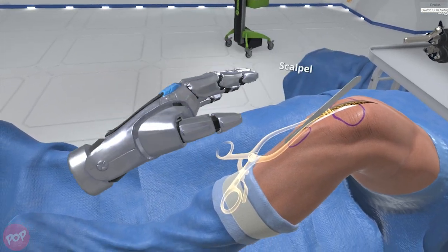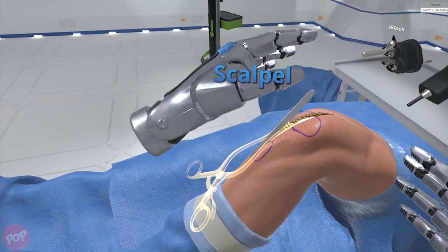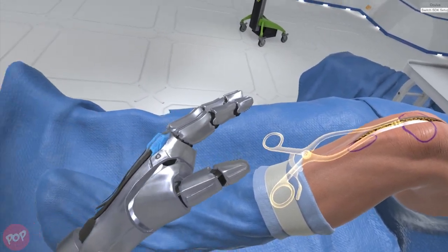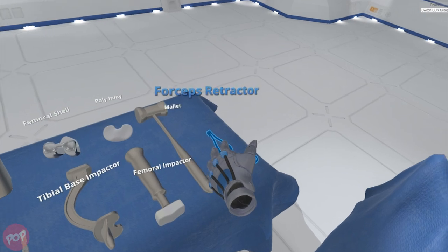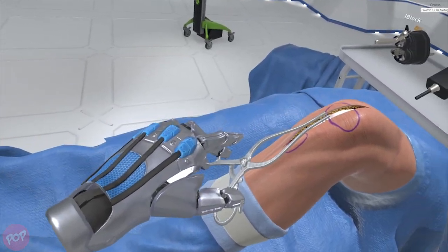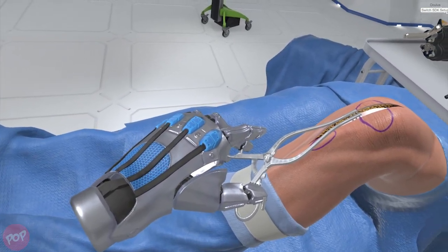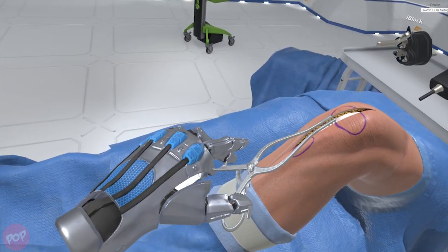You may probe the margins of the incision with your finger. When you are ready, use the retractor on the Mayo stand to expose the fascia surrounding the joint capsule.